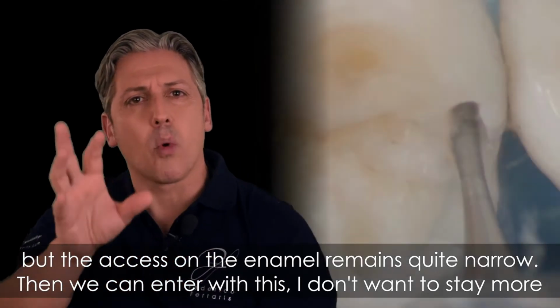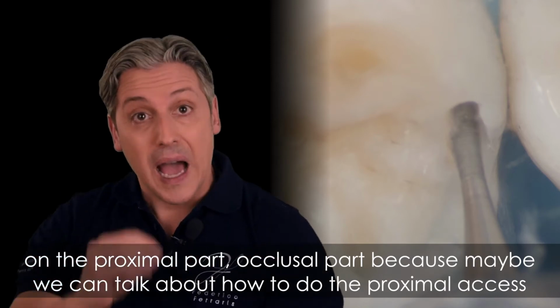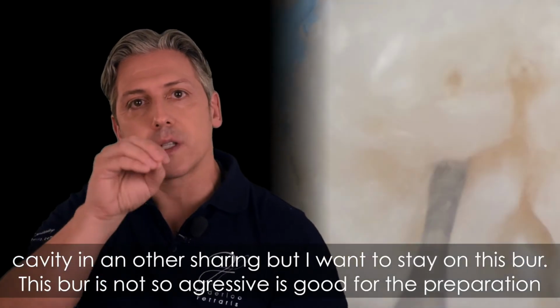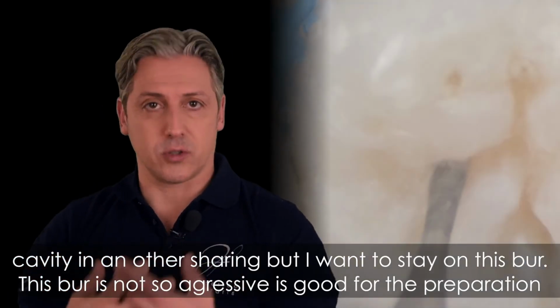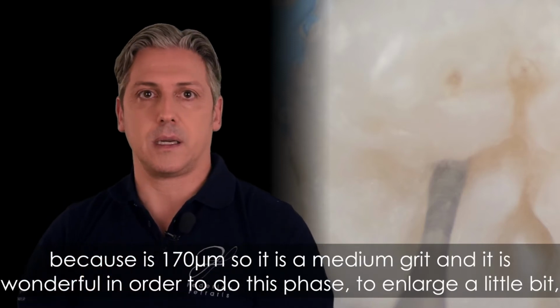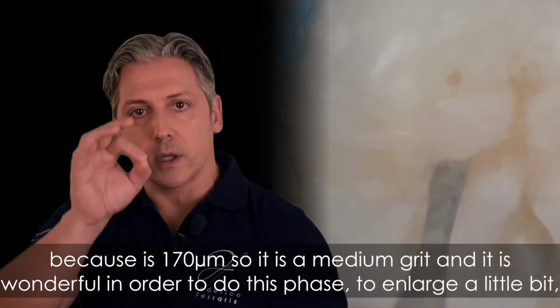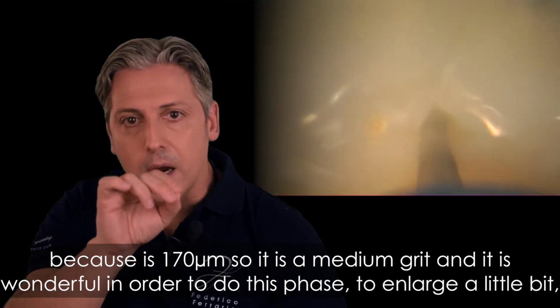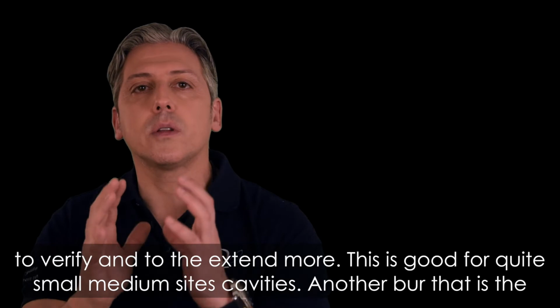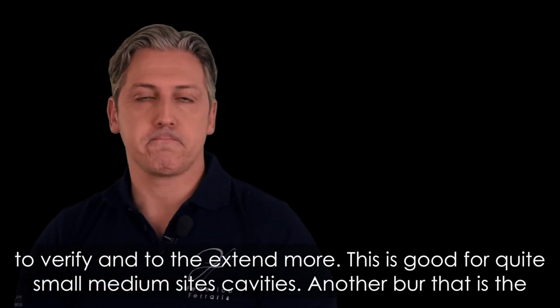I don't want to stay more on the proximal part or occlusal part, because maybe we can talk about how to do the proximal access cavity in another sharing, but I want to stay on this burr. This burr is not so aggressive. It is good for the preparation because it's 170 microns, so it's a medium grit, and it's wonderful in order to do this phase, to enlarge a little bit, to verify, and then to extend more. This is good for quite small, medium-sized cavities, okay?